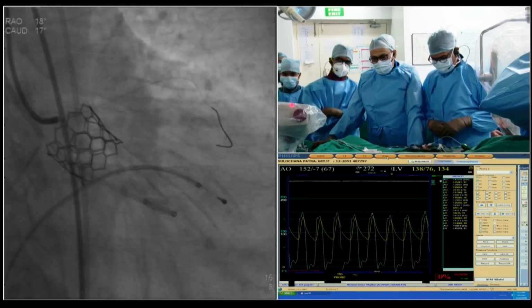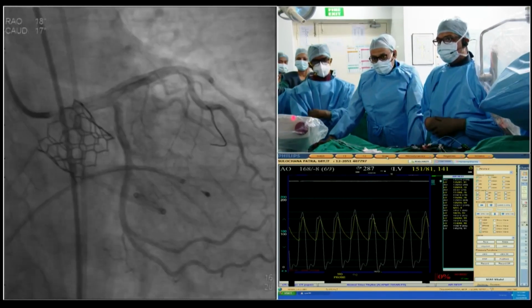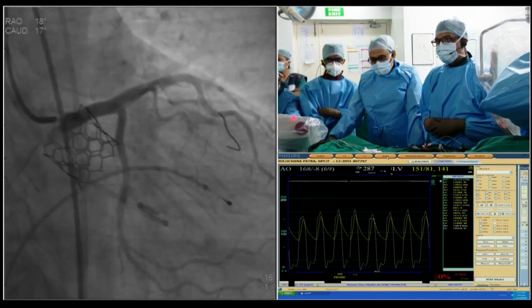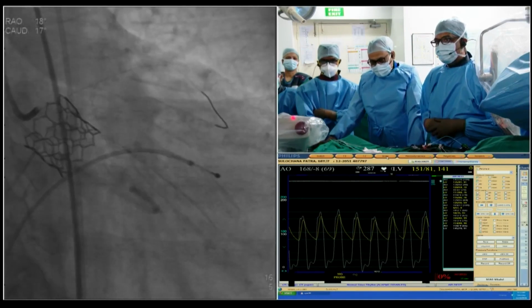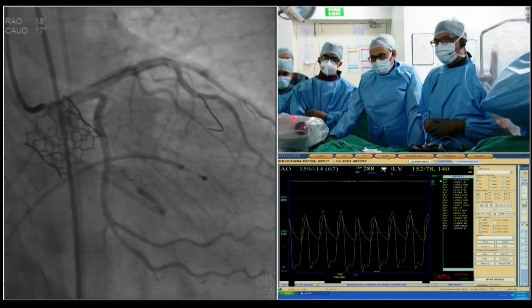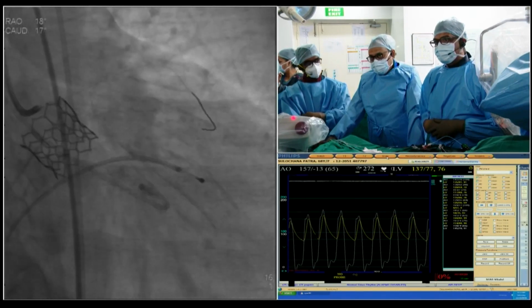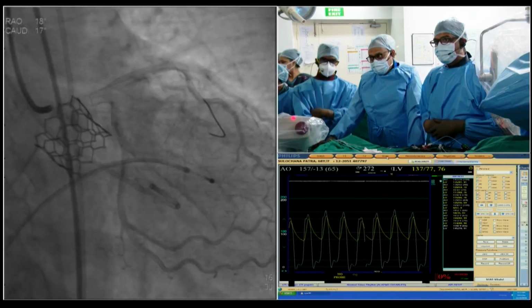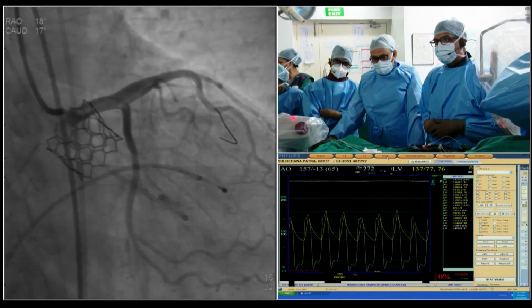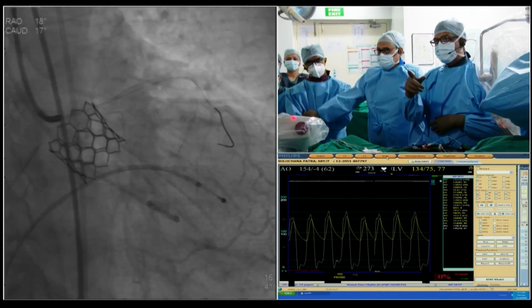So I guess, Ramesh, your leaflet is going above the coronaries, if you see. And this flow could just be because your guide liner is over there, keeping the leaflet away, and the flow is there. So I would suggest pull back the guide liner, leave the wire over there, wait for some time, and then take an injection to see. They did that. The last shot was with the guide liner pulled back.